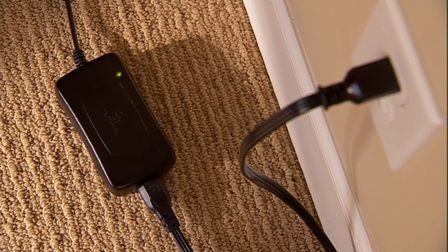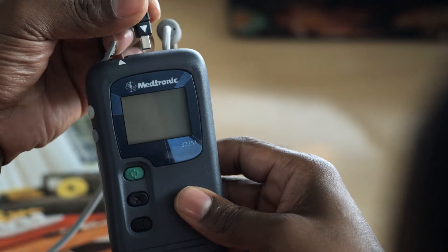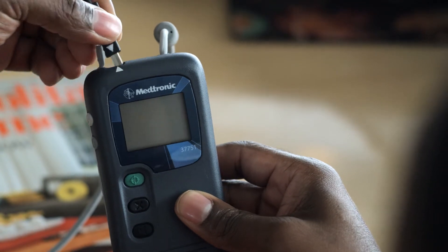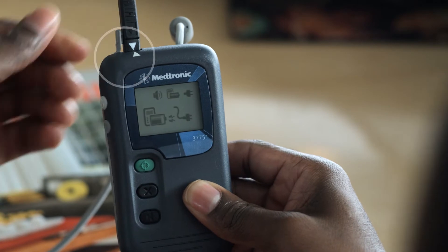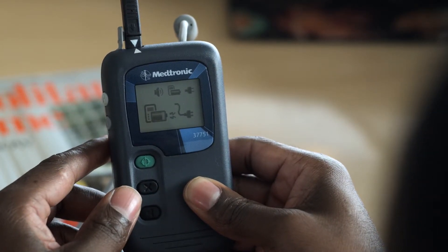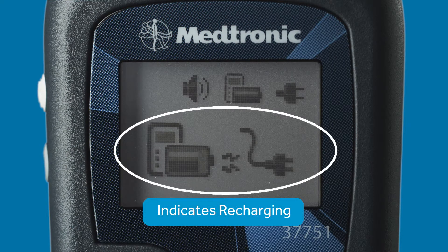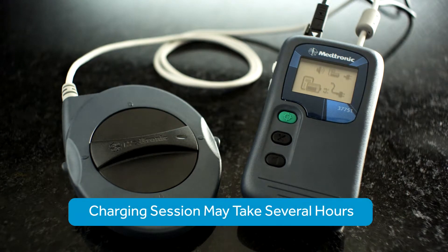To charge your recharger, plug the power supply into an outlet. The green light shows it has power. Then connect the recharger to the AC power supply, aligning the two white arrows like this. The recharger automatically starts its charge when connected to the power supply. The lower half of this screen shows that the recharger is being charged. The charging session could take several hours depending on the battery level.